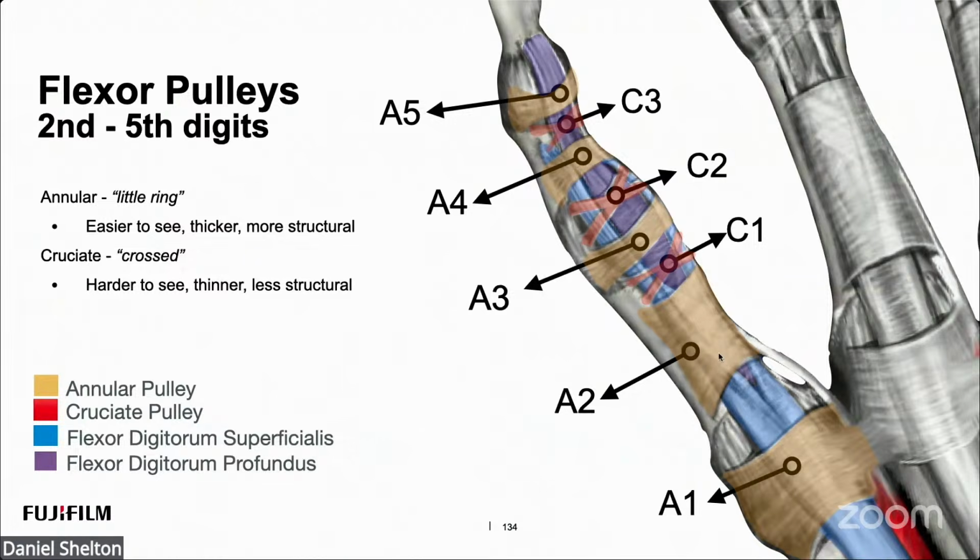So we have the A1, the A2. That's anatomically very consistent. You can have anatomical variation from here on. It's not always going to look like this, especially if you go check out the surgical anatomy atlases. So if you get frustrated not finding the pulleys exactly after A2, the way you see on this diagram, just know that there's a lot of variation.